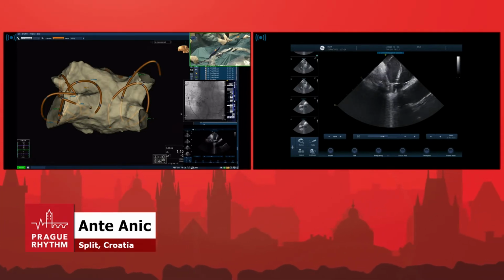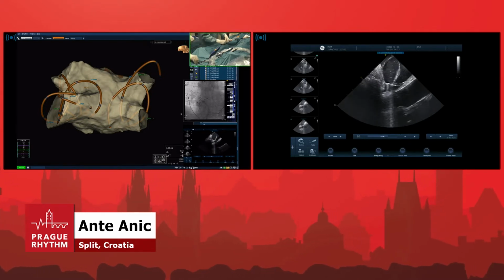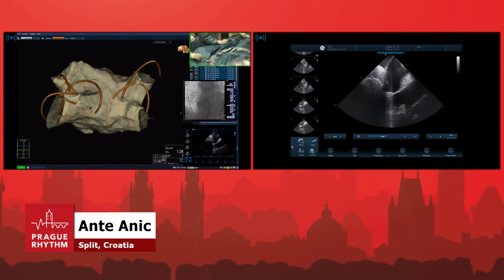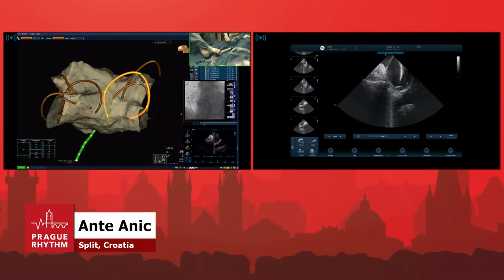Okay? So now we are traveling. We delivered anterior, we delivered lower. Now we're coming down. Actually, I want to come down. Yep. Actually, I know my wire is in, but guys, I have to take care, no, it's too much down. Okay. So I think I'm taking the segmental approach.